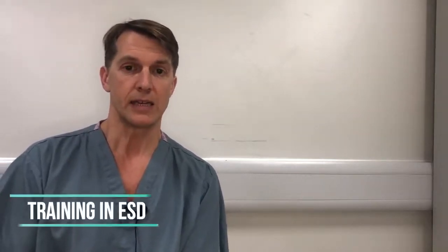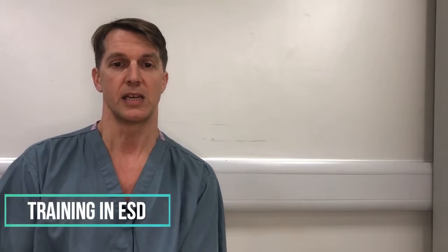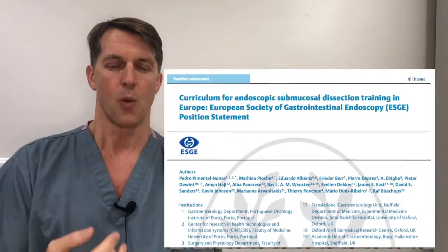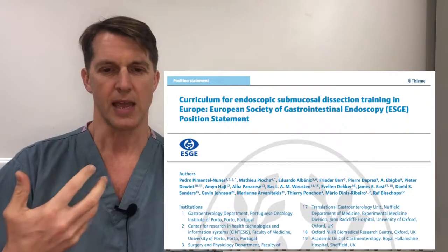Now, in terms of training, it takes many years to learn how to do ESD well. There is a European core curriculum which has now been developed, which sets out a structure for training, from understanding advanced endoscopic diagnosis and characterization of these lesions. You must have proficiency in EMR, and particularly managing the complications of therapeutic endoscopy.